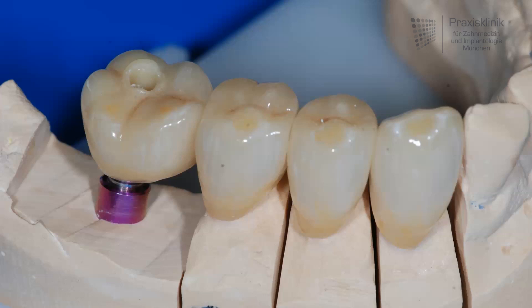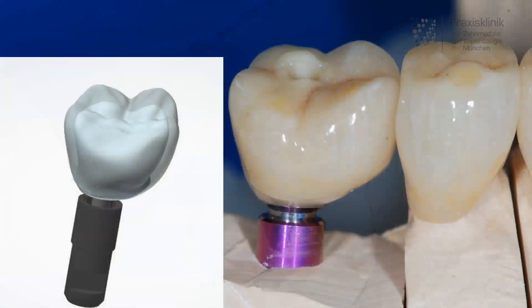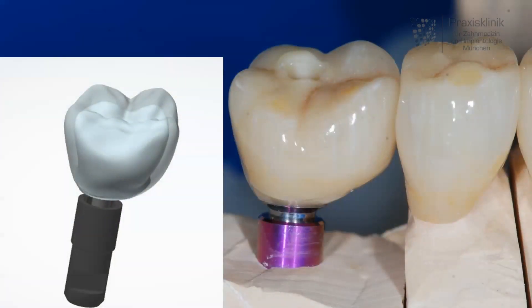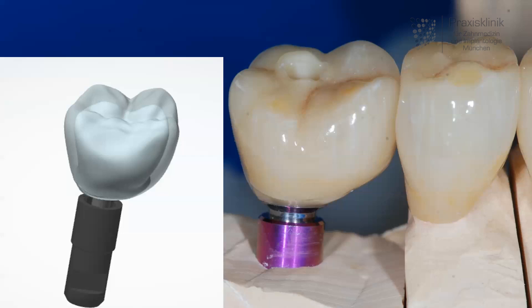The premolars and the canine were also restored by all ceramic single crowns. The material we use for this kind of restoration is lithium disilicate ceramic, which has high aesthetic and functional properties. To achieve a very precise fitting of the restoration, this kind of restoration is fabricated by CAD/CAM procedure.